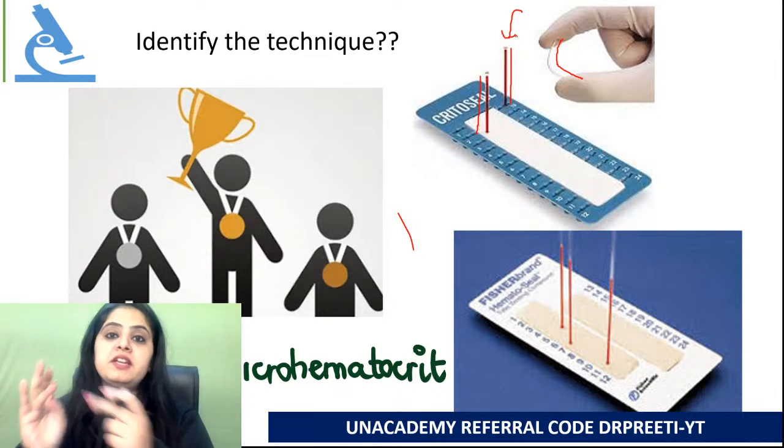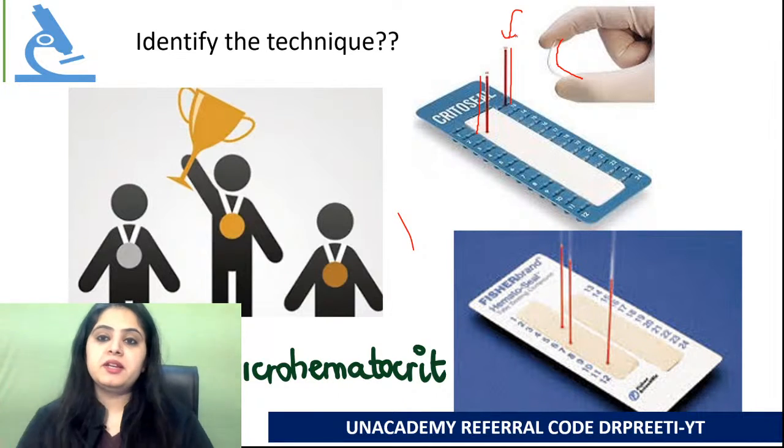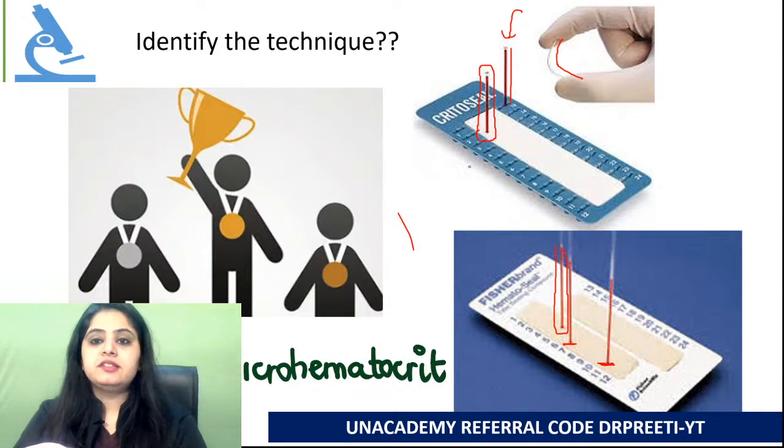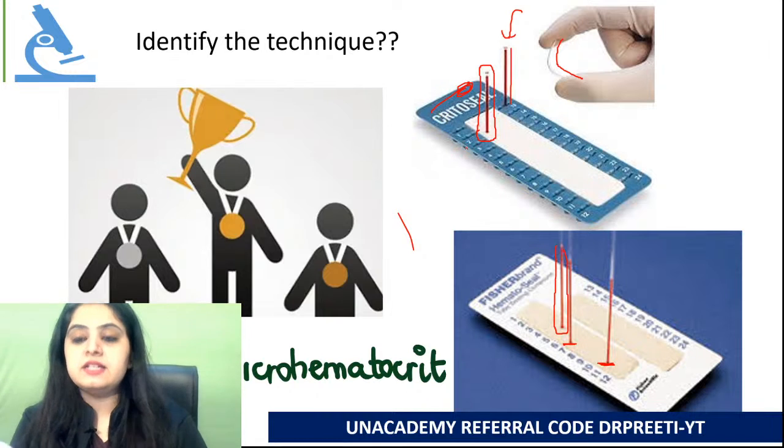I could only do it from a finger prick. So I do a finger prick and fill up this very thin tube. Do you see, I've made it stand on this sealer. It's written also Crito seal, that must be the company. One end of it will be sealed at the bottom.